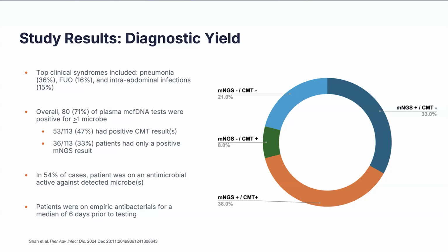It's for the clinicians who are using Karius to remember that the test has limitations. For instance, if you have a patient coming in with a viral respiratory tract infection, which are mostly RNA viruses, Karius is not designed to pick up RNA viruses, so it would not be good to send it. You're going to get a negative test. Similarly, for localized infections like mucosal infections limited to the gut, where you may have C. diff or colitis due to some other organisms, a GI pathogen panel is probably preferred, because you may not have systemic cell-free DNA circulating in the blood for Karius to detect. So this helps us think about how to send the test.